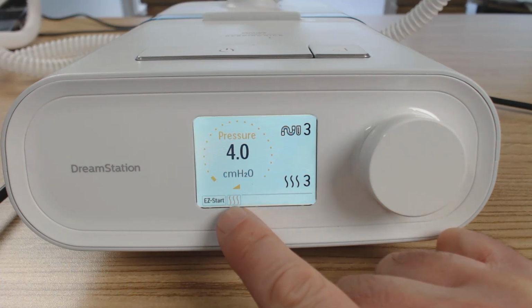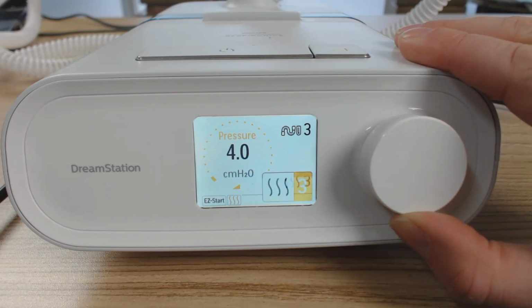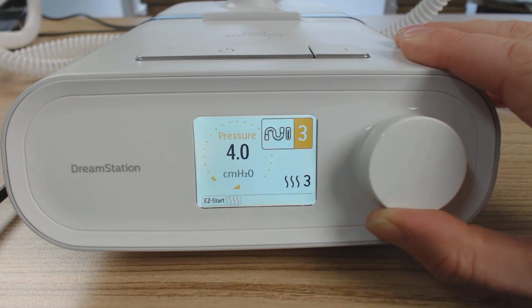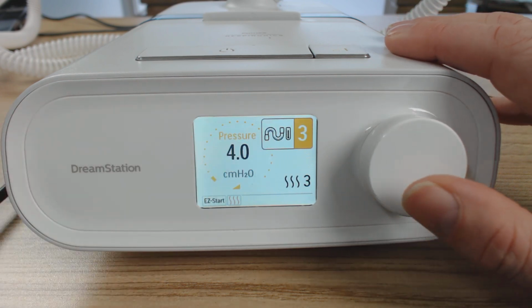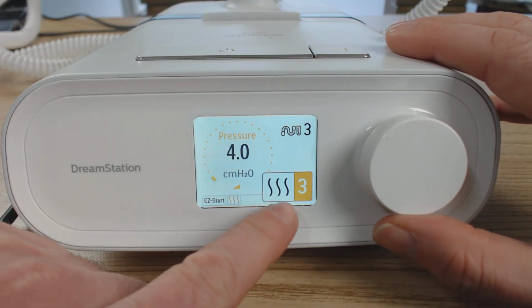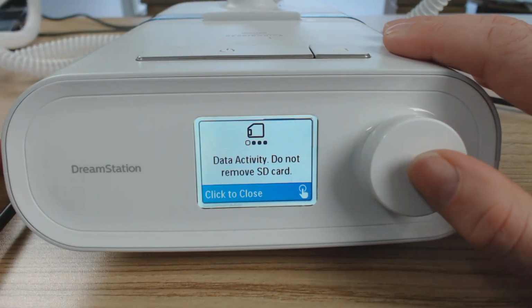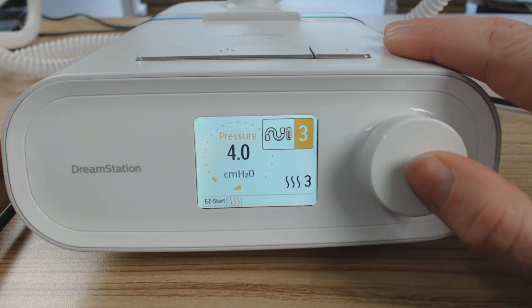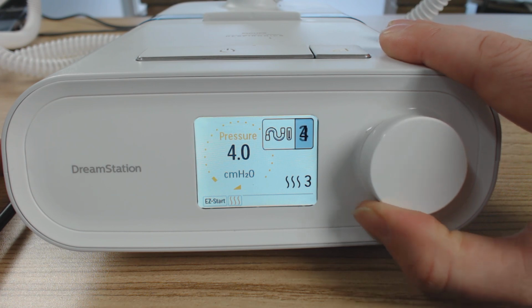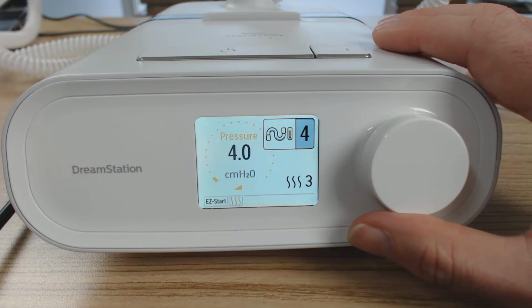These values down here are showing that we've got our preheat on there, so the preheat's on. If I rotate this dial backwards and forwards, so clockwise and anti-clockwise, you can see it's shifting between these two values. The top value up here is the heated tube, and the bottom value is the level of humidification, so how much moisture is in the air. If I click this one while it's highlighted, I can change that number there. That's changing the level of heated tube, so how hot that tube's getting.